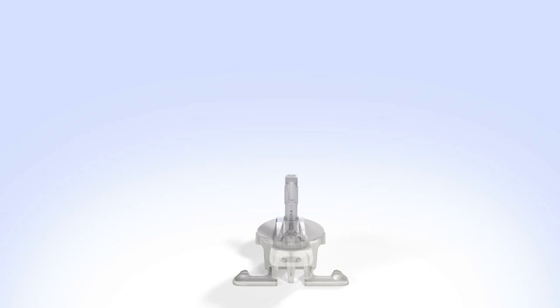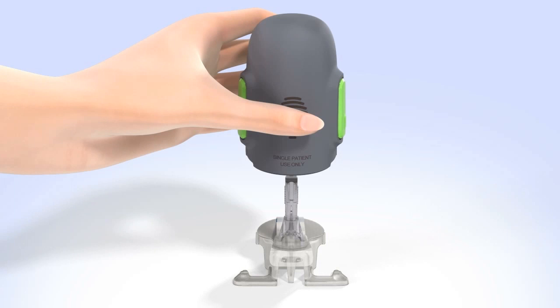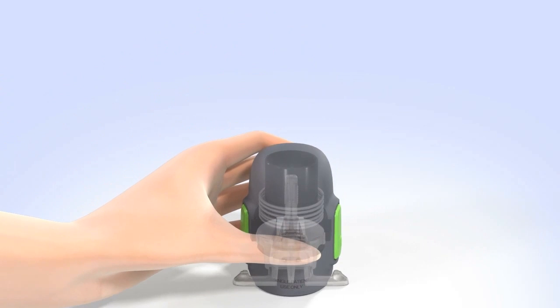Hold the surter so your thumb is on the thumb print. Be sure your fingers are not touching the green buttons on either side of the surter. Carefully push the surter down onto the sensor and pedestal until the base of the surter sits flat on the table and you hear a click. Do not push the surter too hard onto the sensor as this might cause the sensor to load improperly.